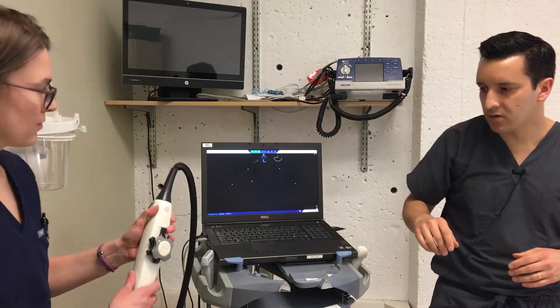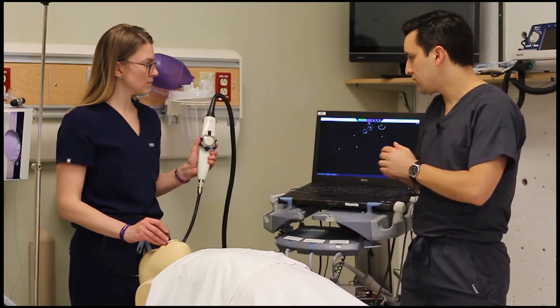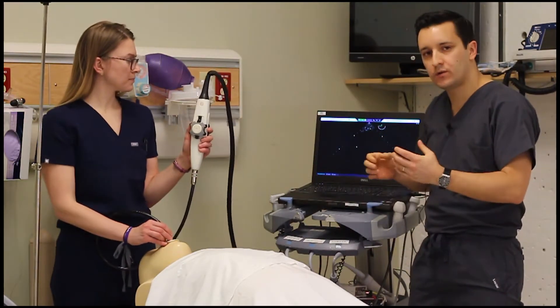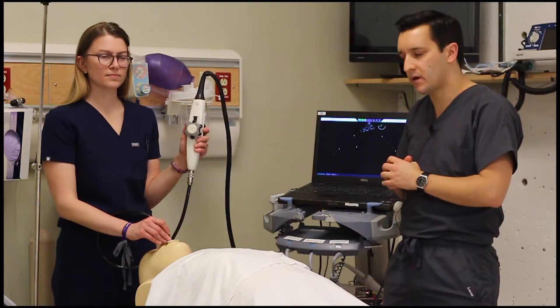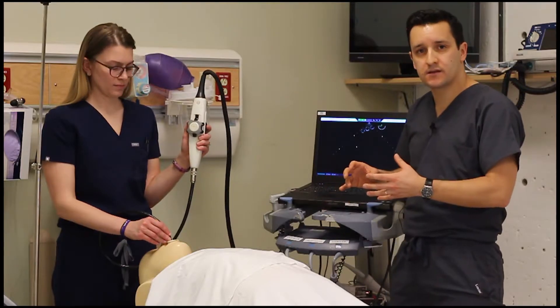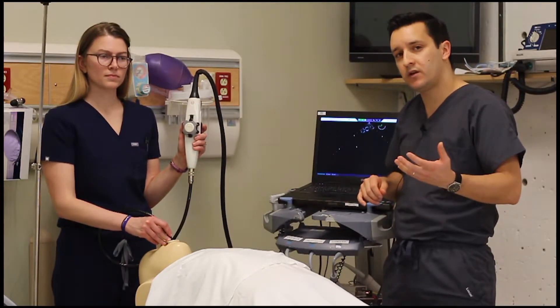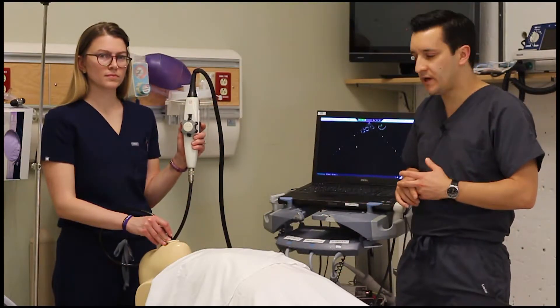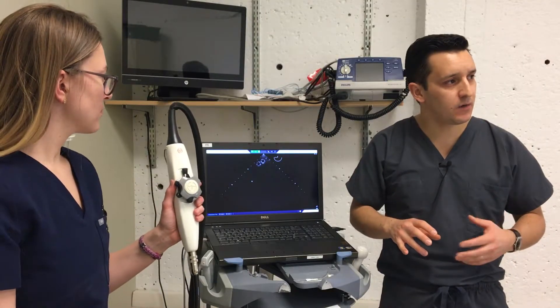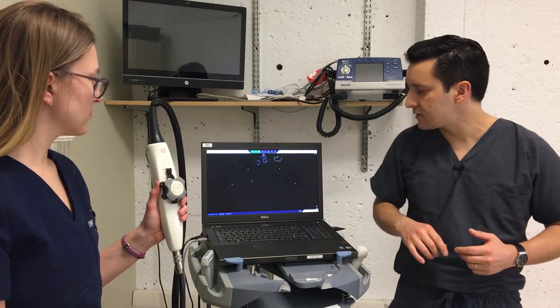Now that we have covered those fundamental movements, we're going to switch to our Heartworks high-fidelity simulator to demonstrate the actual development of these four views in this protocol. Unfortunately, we cannot simulate the process of probe insertion in this mannequin — we have a separate video demonstrating the probe insertion procedure. We're going to assume that we have successfully intubated this patient and successfully introduced the probe into the mouth and into the esophagus.